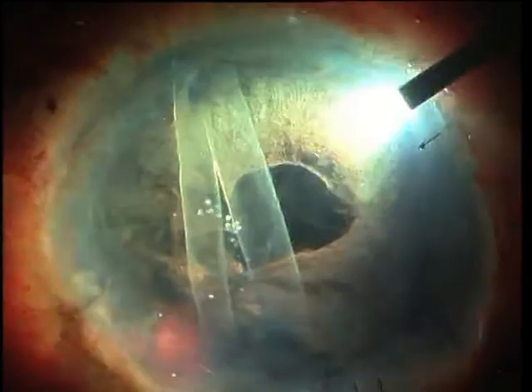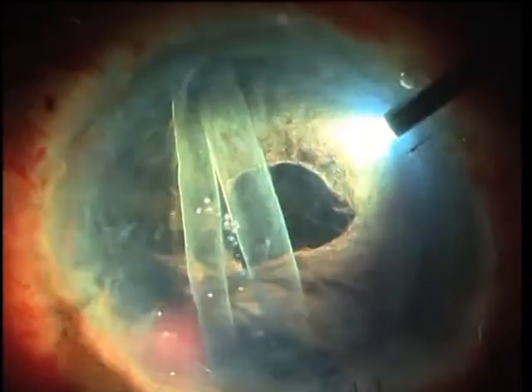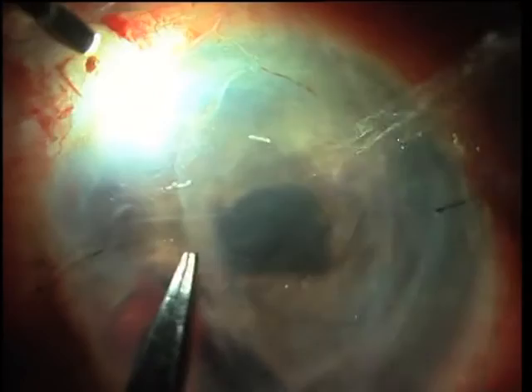The oblique light gives three-dimensional depth perception. The comprehension by the surgeon of the graft orientation and graft dynamics within the anterior chamber is much better, and the direction of the graft can be easily made out. The unfolding of the graft can also be carried out with just the endoilluminator light alone.